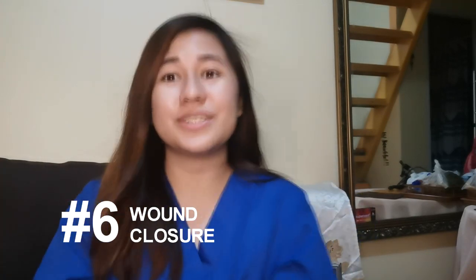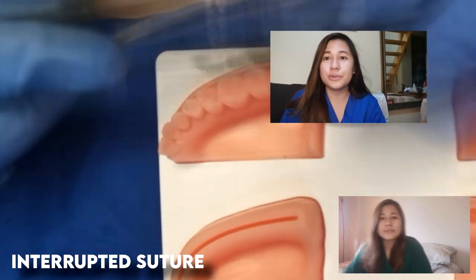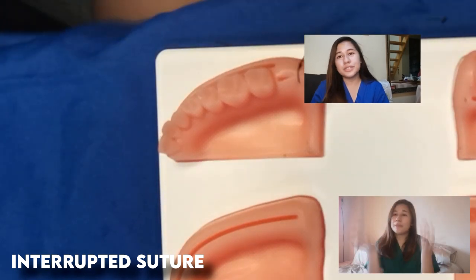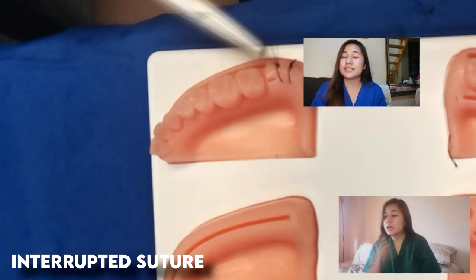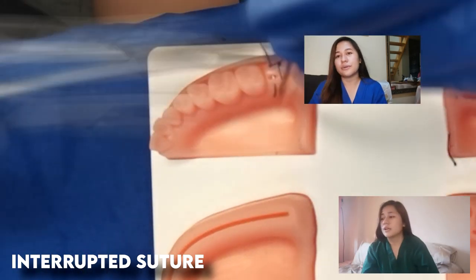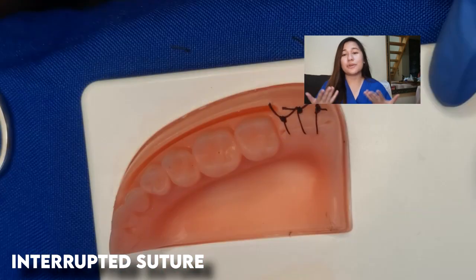Next is wound closure. Since the casus made the flap, I was not able to perform the wound closure; however, I will show you my previous work wherein I performed an interrupted suture, because it is the most usual and ideal for an odontectomy — odontectomy is one of the indications for performing an interrupted suture. If the flap was well designed and not traumatized, it will perfectly fit into its original position.